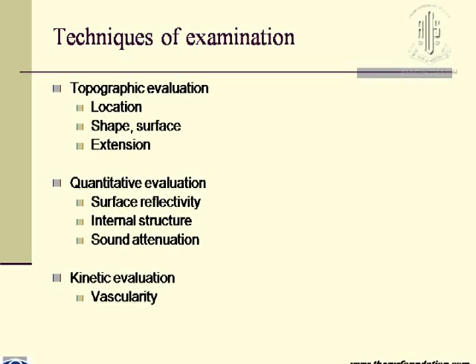And then we do a kinetic evaluation, where the probe is held steady and any flickering movements on the A scan will indicate the vascularity of the lesion. And all these findings are taken together to come to the final diagnosis.